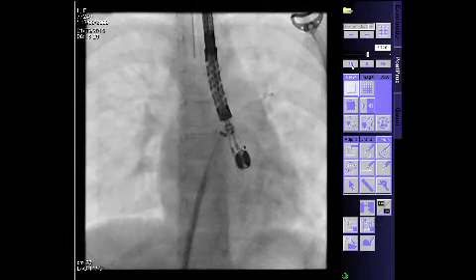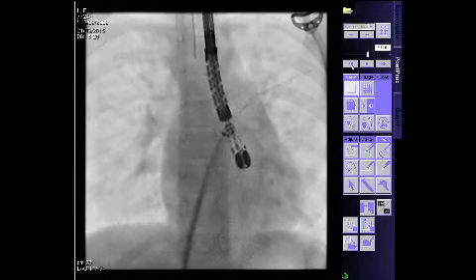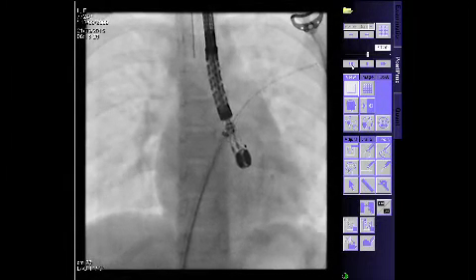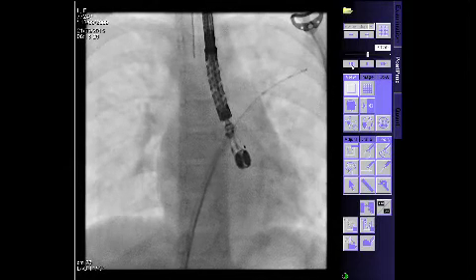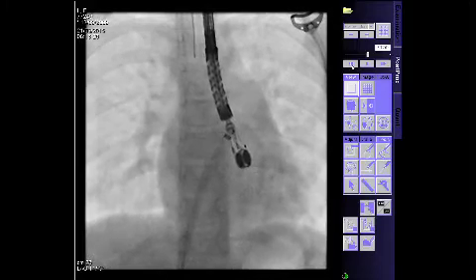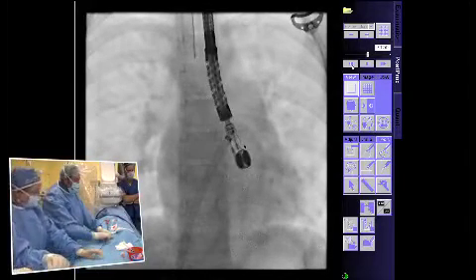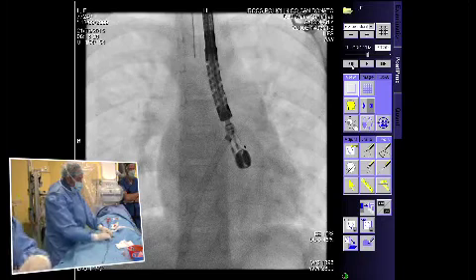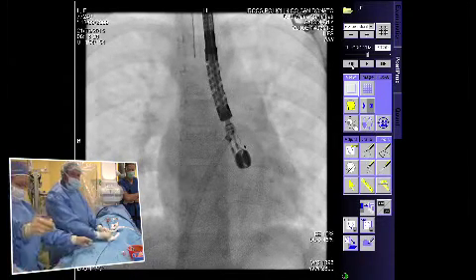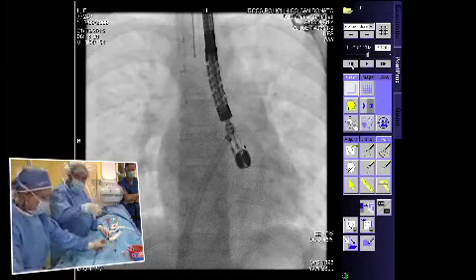My preferred technique is just to withdraw the dilator, leaving a wire inside, and let the blood come out of the sheath. A backward flow, keeping the sheath below the zero line. Can you go to my hands, please?